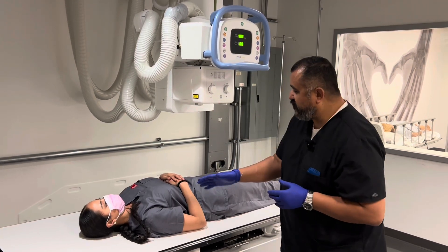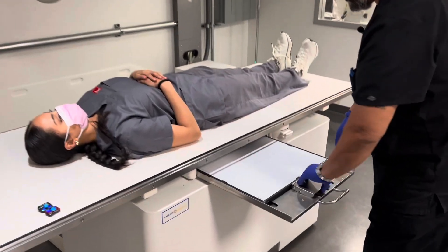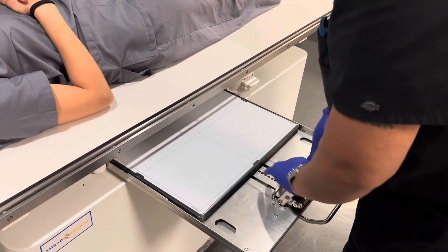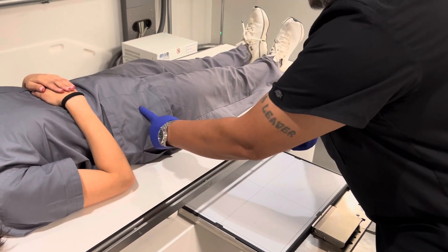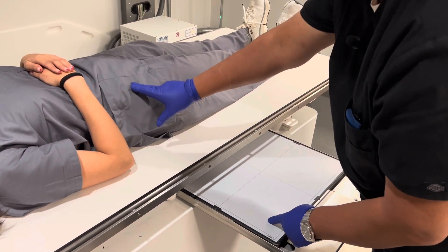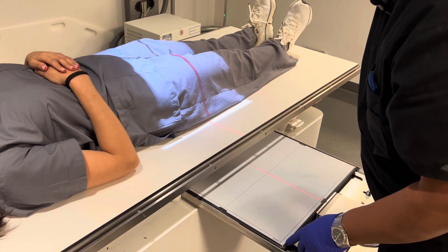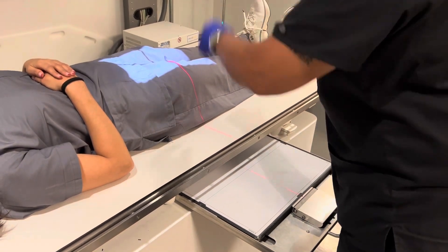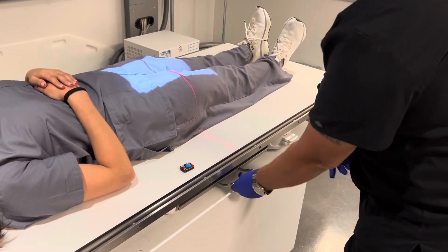We're going to go ahead and get started. We have our patient — she's lying down on her back, supine. What you want to do is have your receptor lengthwise. You're going to go ahead and put the top of the IR at her ASIS. Her crest is up here, her ASIS is right here — it's going to be the most prominent portion. We're going to center that, then collimate to the width of her thigh. We're starting off with the proximal first.